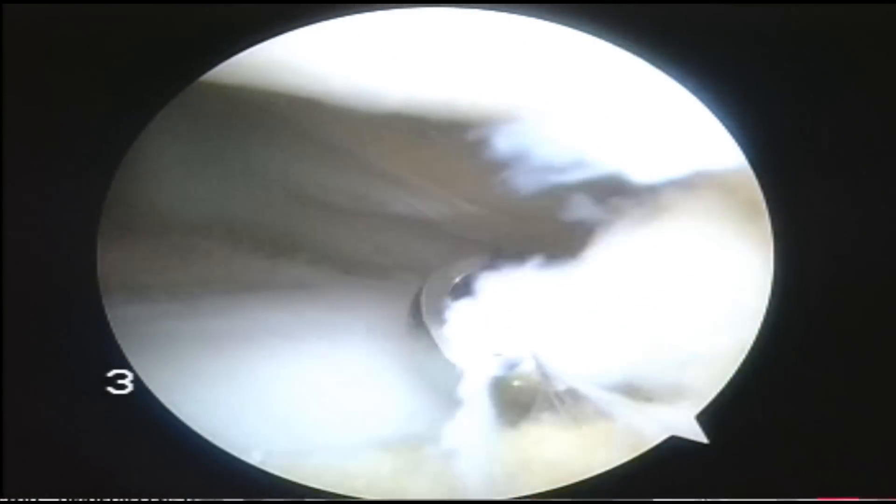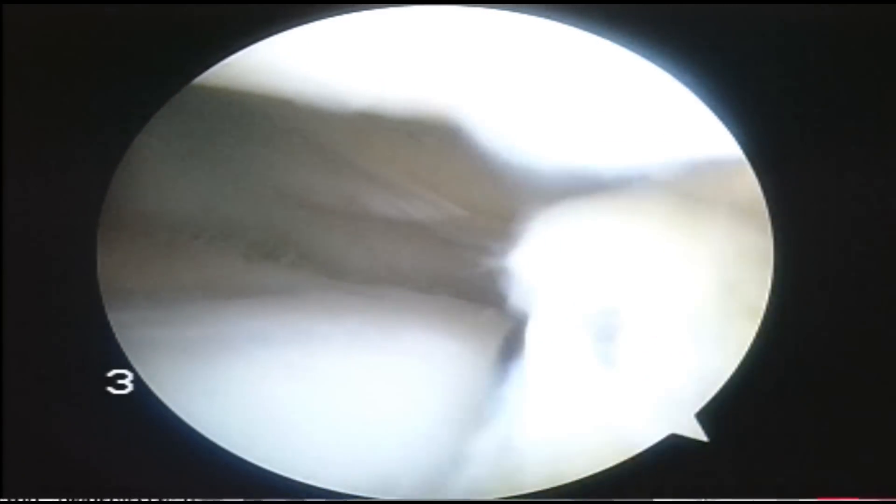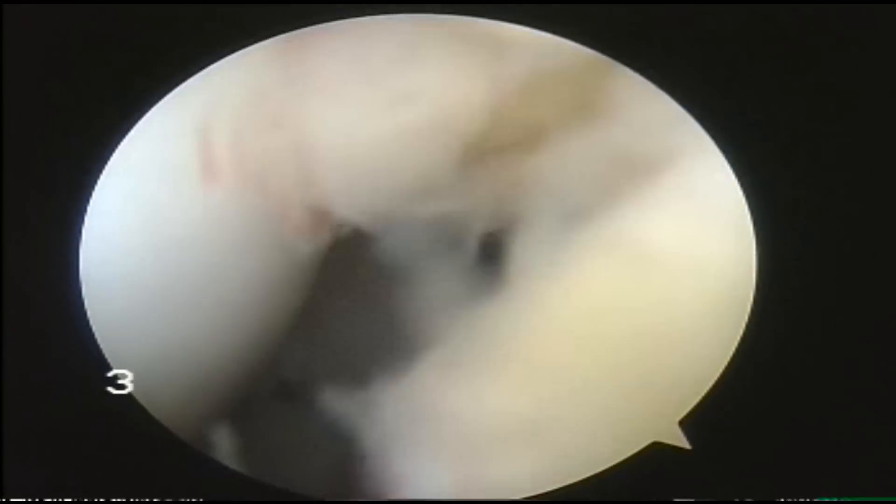The next thing I'll do is take a Smith & Nephew incisor plus and remove that bit of the medial synovial shelf or medial plica that's shaving away at the surface of the joint.